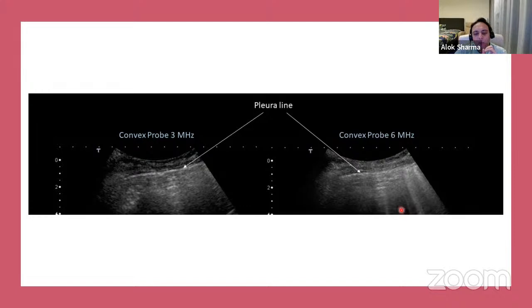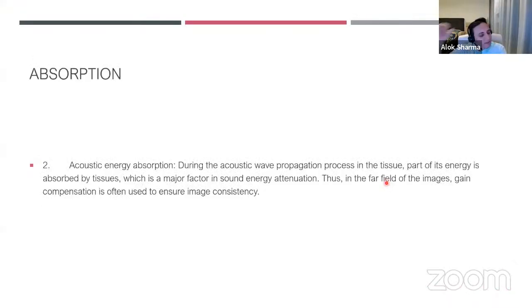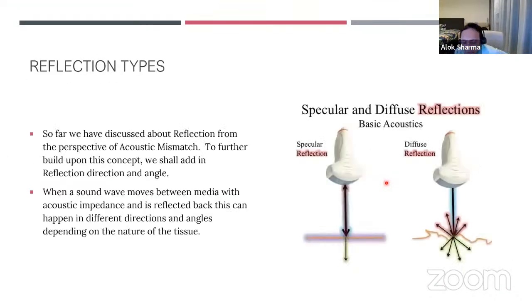And with time, when you use your probes, you will get used to making clinical interpretations which need to take these limitations into account and need to clinically correlate. I cannot emphasize that enough. These are adults, hence the frequencies being lower. But I think I've emphasized the point that differences in frequency are very important when you're looking at the actual lung ultrasound. We've talked about absorption.